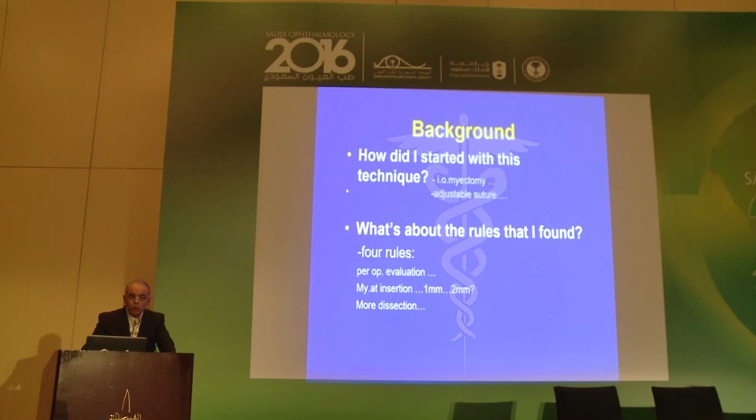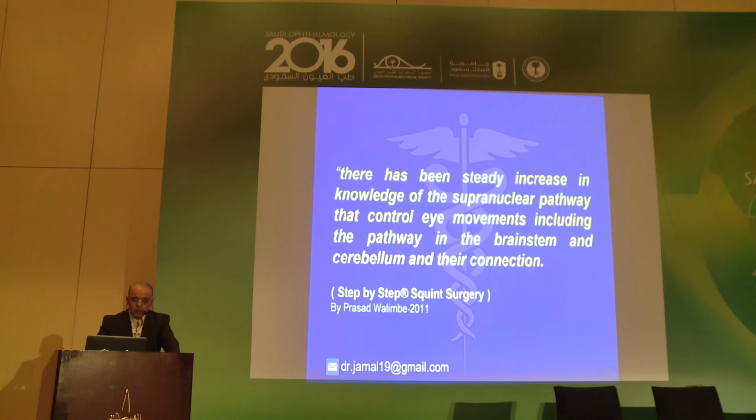You have to do more dissection if the squint degree is very high. Also, in some cases, I put a tractional suture in the direction I need the eye to move to, for either 7 days or 12 days, as an assist.